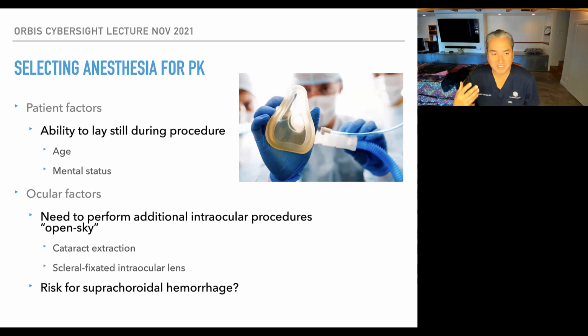This goes with the patient's age and mental status. So the younger the patient, the more they're going to not be able to stay still. Also, if you're going to need to do other additional intraocular procedures like an open sky cataract surgery or fixating a lens, which I'll show you some videos later, those may make you want to do it under general rather than with a block.